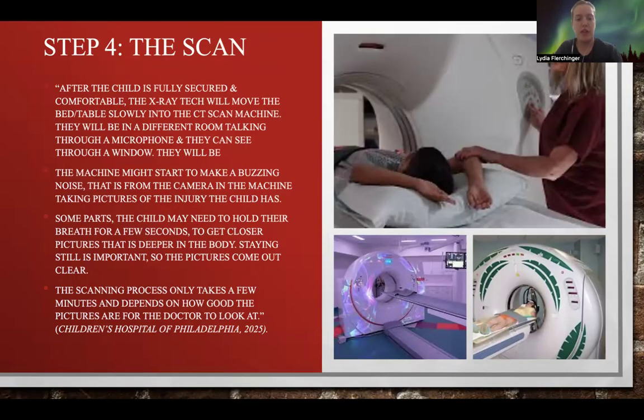And then after a few minutes, the scanner will be all done. Then the doctors and the technicians will see how good your pictures are. And if they need to do it again, then they'll have to do it again.